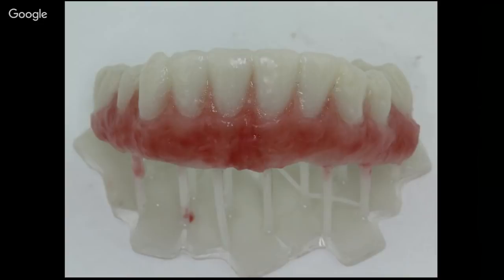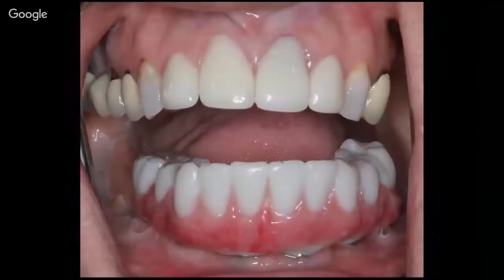This was literally the very first time I ever used this material and got this result. And I'm not some superstar lab guy, so I think that says a lot for the quality of the materials and the look that you can achieve. Now, is this as pretty as layered ceramic? Absolutely not. But remember, this is for a temporary application, and this costs literally nothing but the cost of the materials. So whatever amount of material I printed, and then whatever amount of gingival composite I used. I think that's a really cool way to do this.